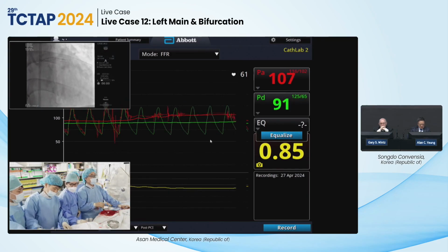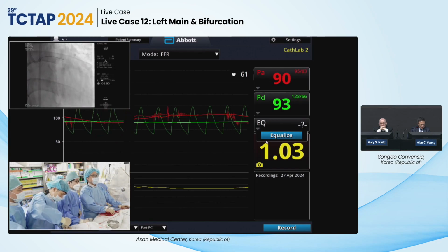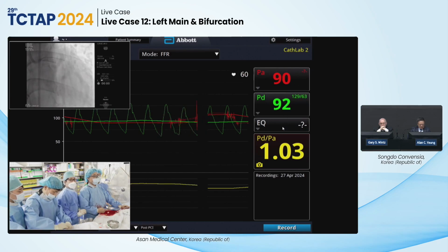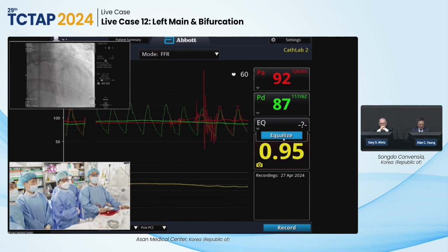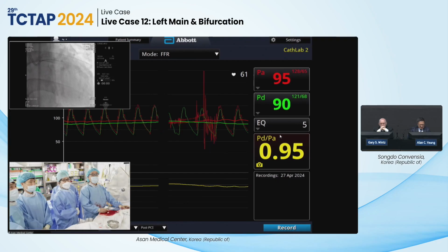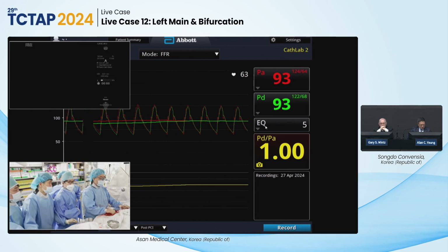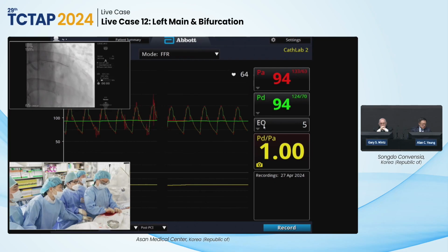All right, very interesting, right? This is mainly influence of muscle bridging, right? It's nearly guiding catheter, the tip was hanging out the left ostium and then zeroing. Yeah, let's equalize it. Equalizing. Great. Okay. Then we're gonna pass the FFR.